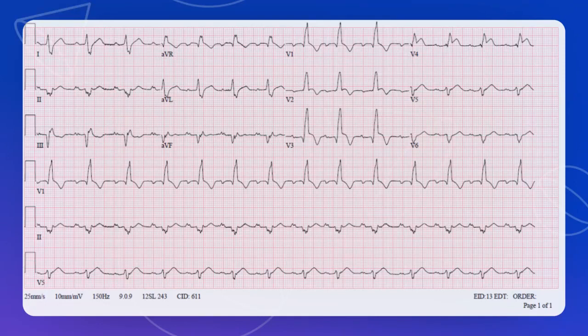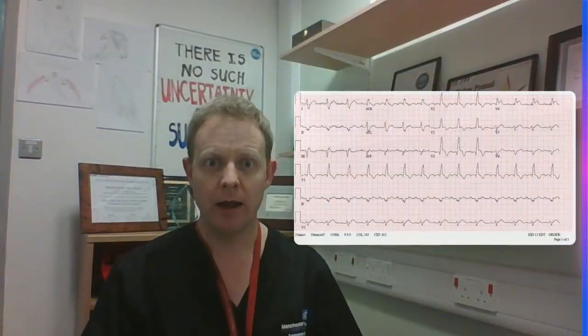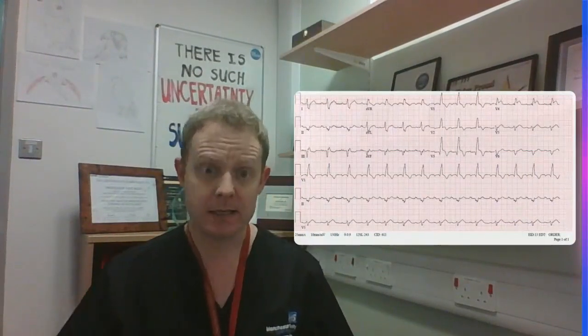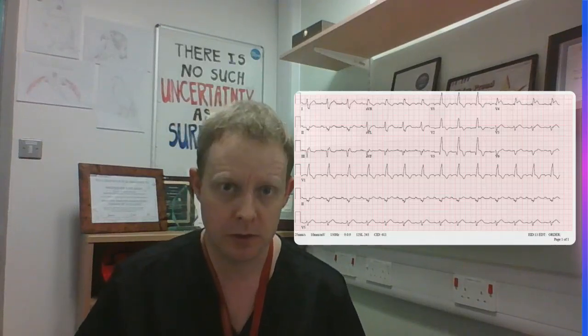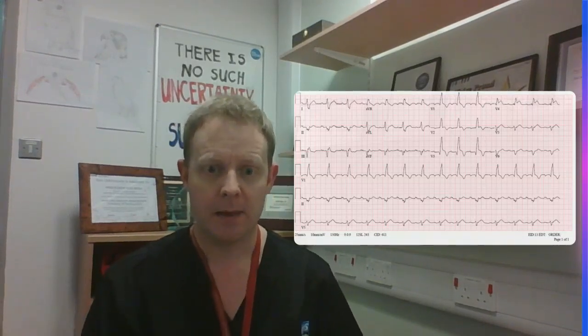The PR interval is prolonged — just over 200 milliseconds on this ECG. So once again we've got trifascicular block, and when the patient is symptomatic we should at the very least be doing electrophysiological studies, and the patient is likely to need a pacemaker. In a nutshell, I've covered bifascicular block and that famous misnomer trifascicular block. If you follow this system, you'll never miss it again on the ECG. Thank you.